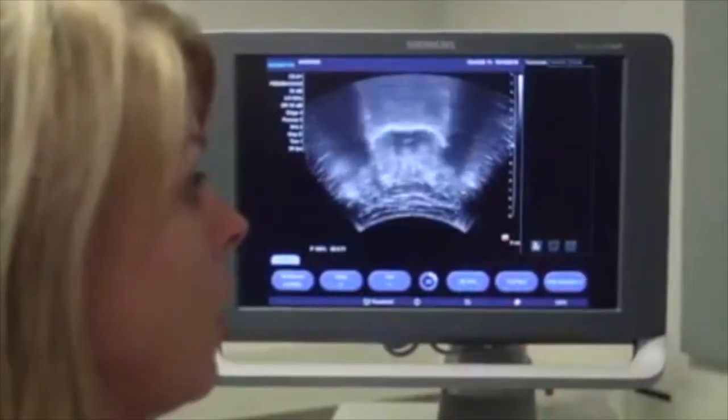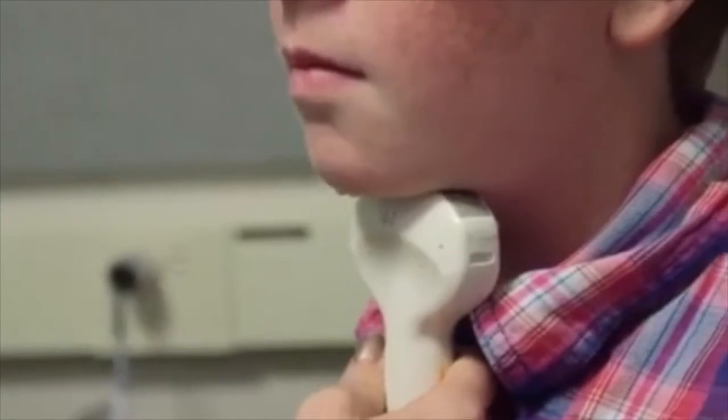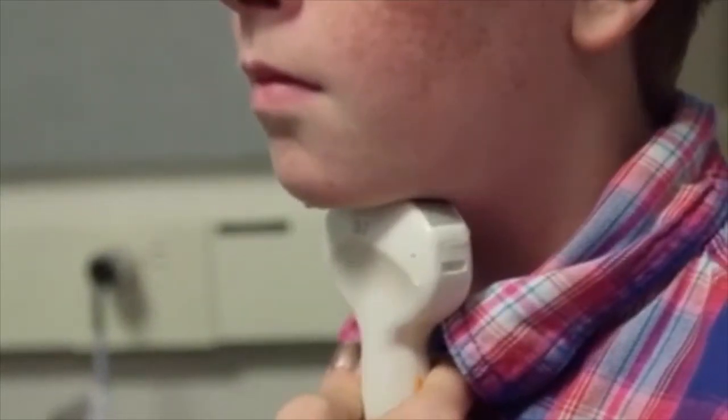Finally, rotate the probe 90 degrees to obtain a coronal view and observe the lateral margins of the tongue as the participant repeats the syllables r, ear, ra, re, and ru. Position the probe near the highest point of the tongue, about 1/3 of the distance between the chin and the throat in the sagittal plane.